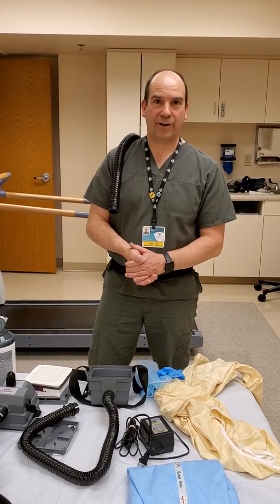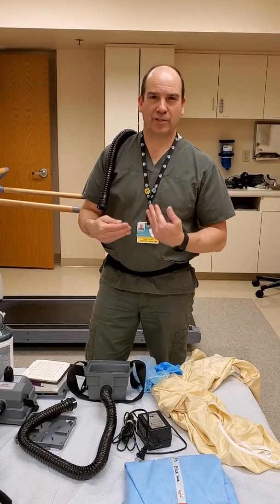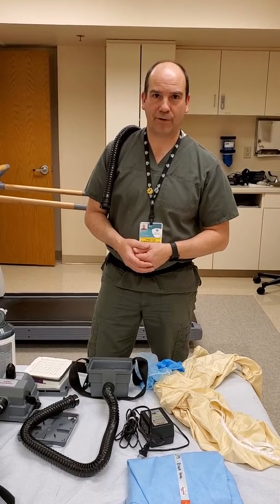Hello, I'm Rob Jones, Director of Cardiopulmonary here at Memorial Medical Center. I'm here to just go over the AirMate 3M PAPR unit.